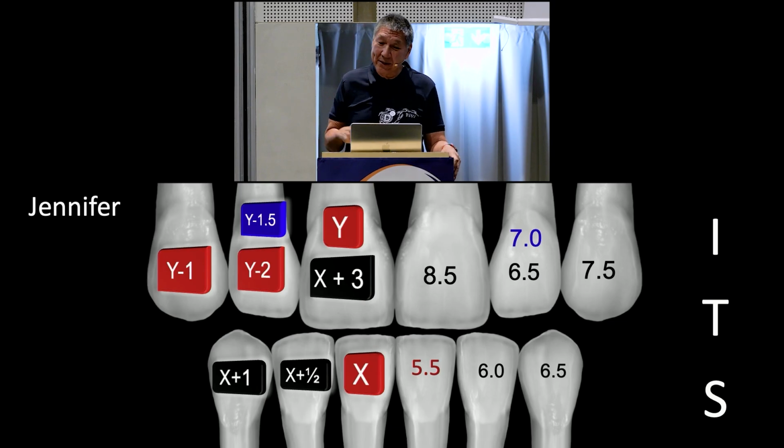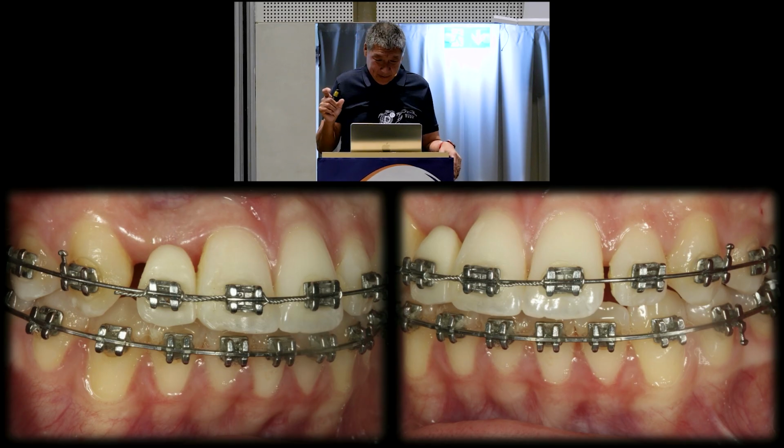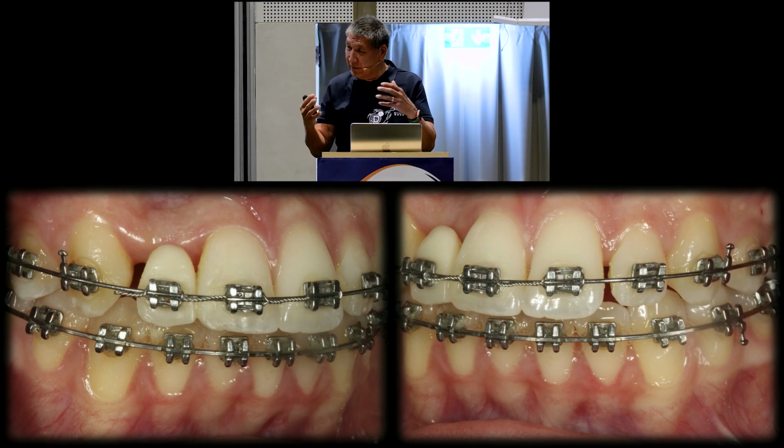What was very interesting to note is that obviously the right lateral incisor was too large, so I reshaped it to the correct width and length. I could use the proportion gauge for that. Her left central incisor, tooth number 2-1, was too wide, so we did a little bit of enamel recontouring of the tooth.